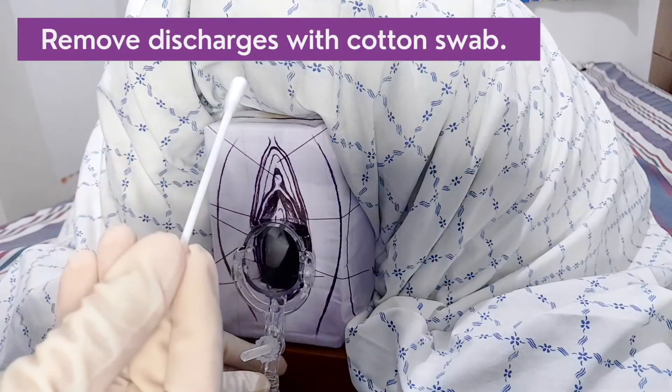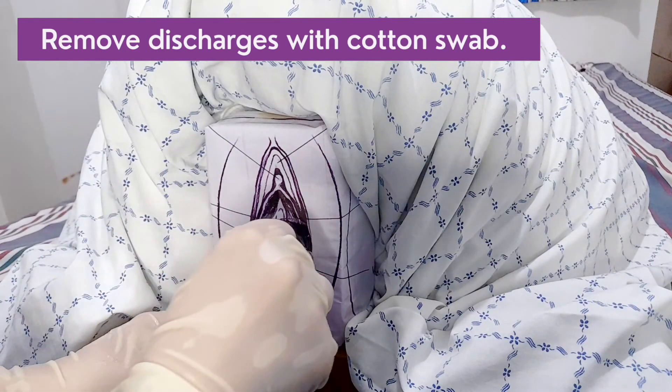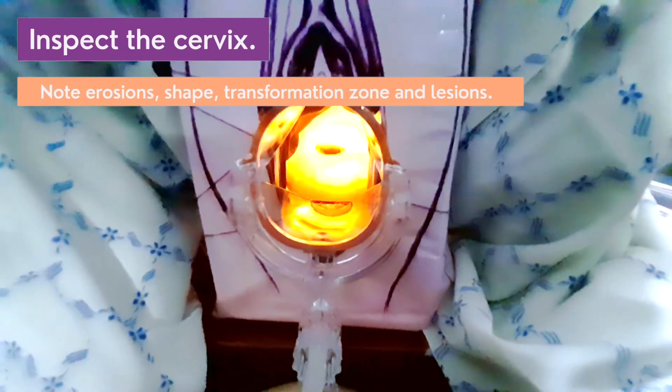Remove discharges. With a cotton swab, you may use this to sample for pH and microbial analysis. Inspect the cervix. Take note of erosions, shape, transformation zone, and any lesions.